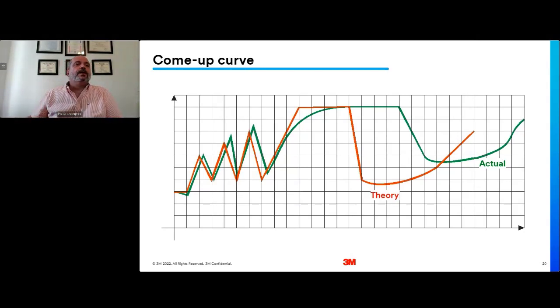But we have to be careful with how our sterilizers are controlled. We have the process challenge devices with the chemical indicators developed according to the red cycle curve that we are seeing here. But when we go into a healthcare site, sometimes we find the cycle running according to this actual graph in green that I have here. And the difference between them is that from the last vacuum point to the initial exposure there is a lag, basically, if each square is 1 minute, of 4 minutes of additional high exposure.